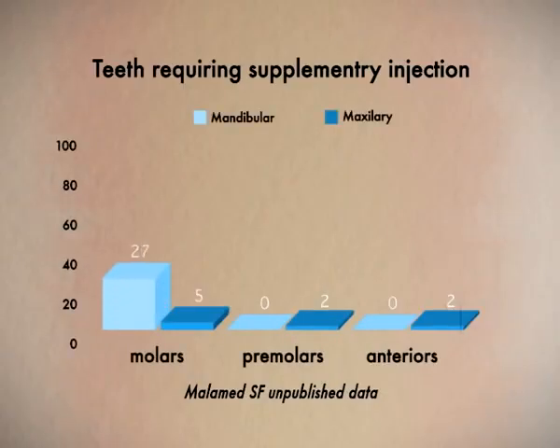Hi, I'm Professor Stanley Malamed, and I'm here today to discuss the Gow-Gates mandibular block technique. Effective pain control is an essential part of a successful dental practice. Normally, achieving pain control is easy. When problems do occur, they most often happen in the mandible, specifically with mandibular molars.